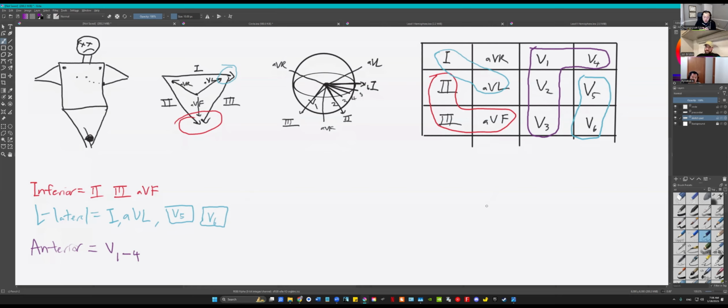If you want a true STEMI, if you have some blood vessel of the heart blocked, you're not going to get abnormalities in one lead only. You're going to get abnormalities in the zone. So what we're looking for is ST elevations. Now remember how I said, if the heart's a steak, if you run out of ATP, it starts looking weird here. All right. So this is the part that becomes problematic.